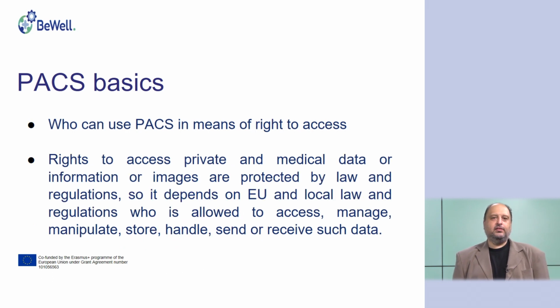Then the other question is who may have a right of access, and this is complicated because these systems contain some private data and medical data, and there are very strict regulations in the European Union about access to this data. So it depends on the laws and regulation, the general EU regulations and laws, and there are some local laws sometimes that are more strict than the general European Union laws. So they regulate who may access the data, who may manage or manipulate, store, and so on.